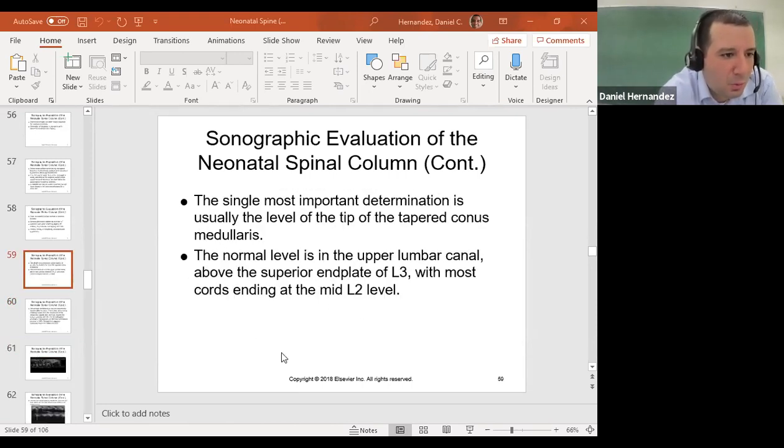You can have a cord that ends between L2 and L3. At that point, it's borderline. It could be up to the radiologist to determine if it's truly low lying. They may want to come in and take a look themselves. But again, you're going to document, take multiple images showing exactly, counting the vertebral levels, and ensure you get a nice panoramic image.